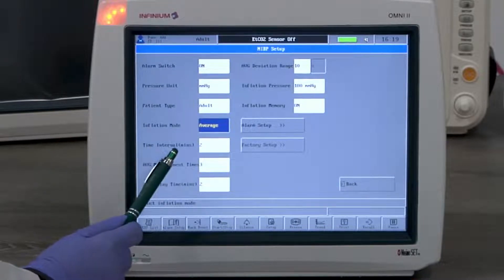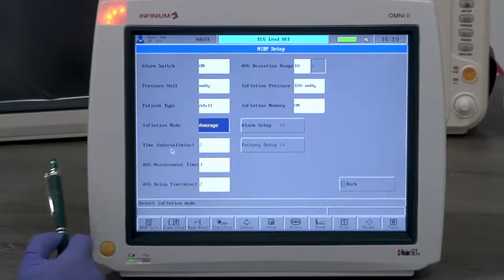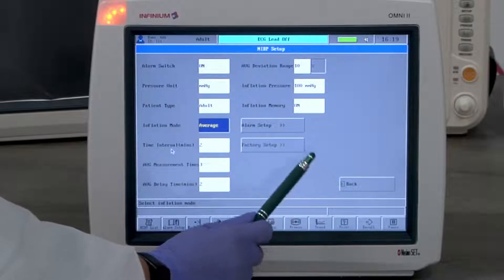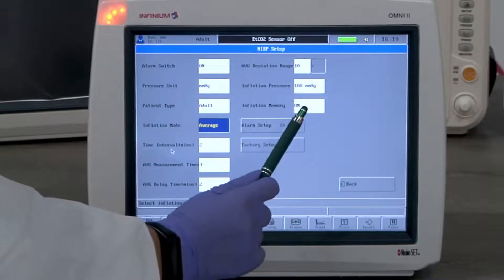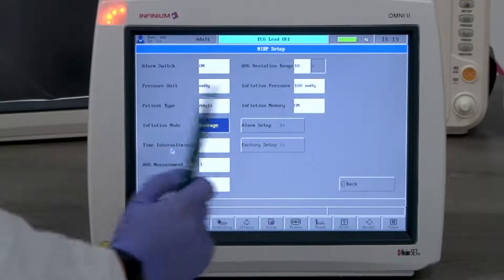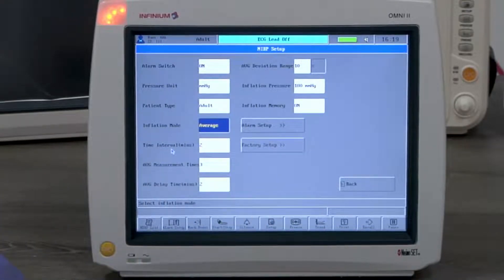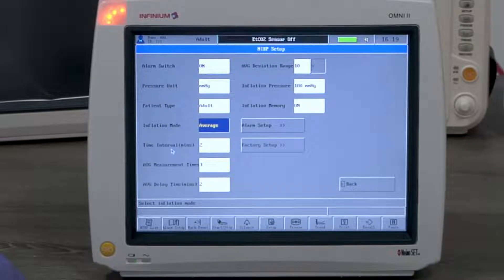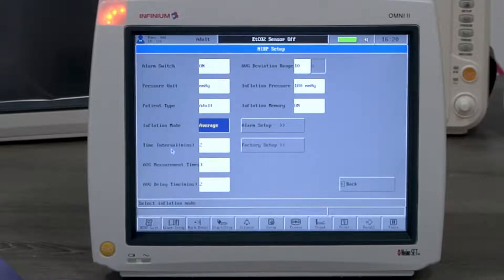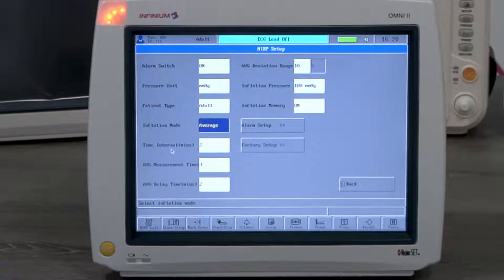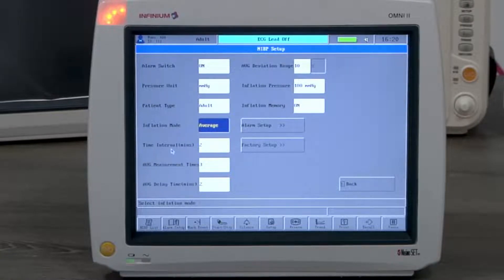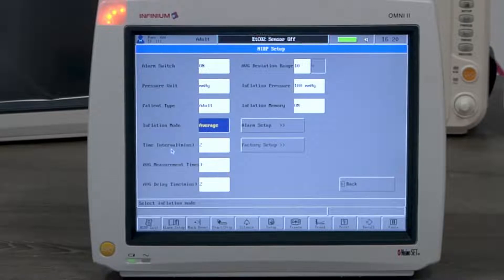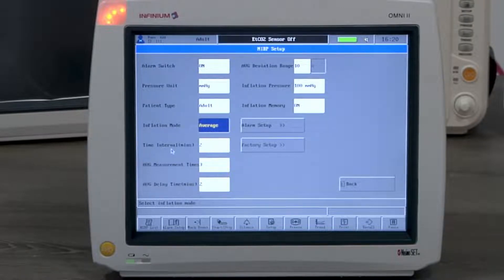The inflation memory's default setting is off. When it's on, it remembers the previous measurement and adjusts the initial inflation accordingly. If the first reading is a high BP, it will inflate to a high pressure at the beginning of a second measurement. This feature is helpful when monitoring the same patient or on a patient group that has similar blood pressure conditions.